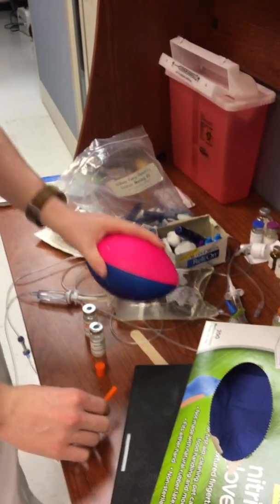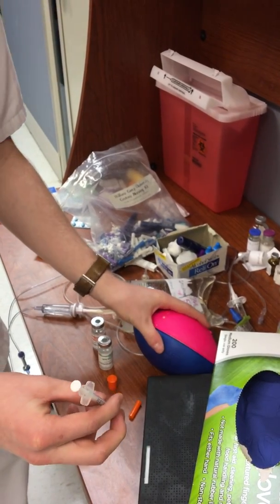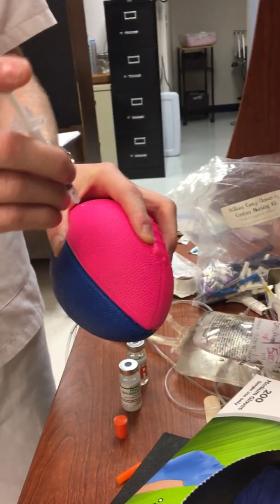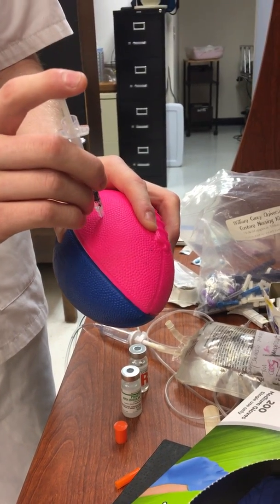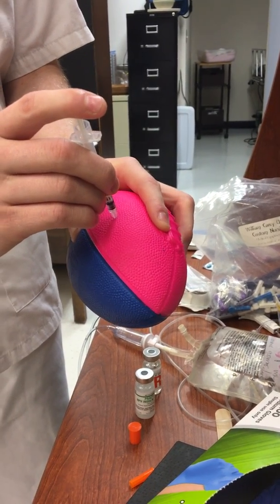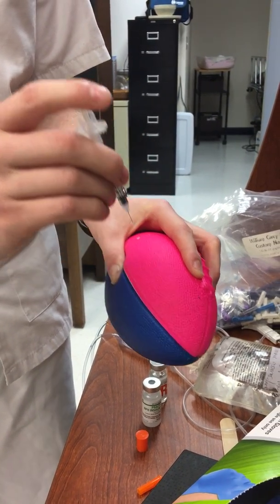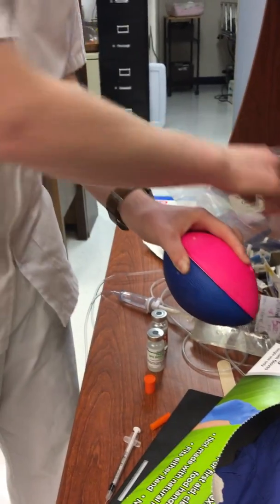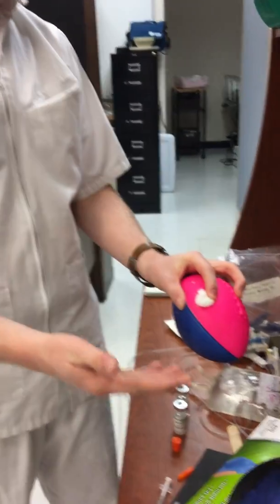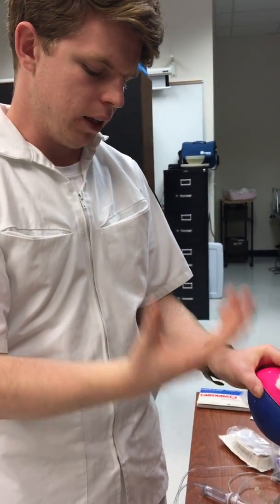So then I would take my syringe. Everything is clean, and I would pinch up the skin, and I would inject. I can pinch about 2 inches, so it's going to be 90 degrees. So then I would inject into the skin and slowly administer the insulin. Once I've got that, I'll let it sit for a second and then pull the syringe out straight and then apply an alcohol prep to the site. That is to make sure that we don't have any kind of infection, or to make sure that we have all the insulin injected and none of it leaks out.